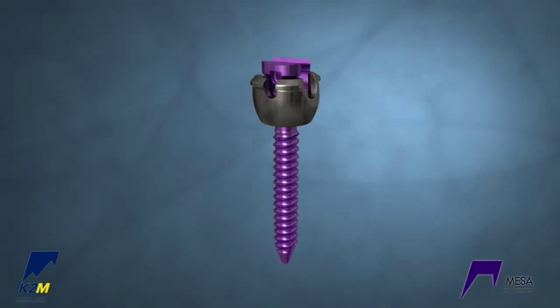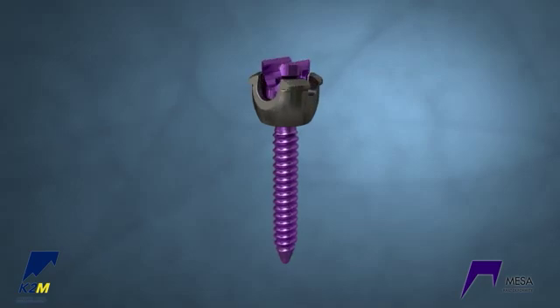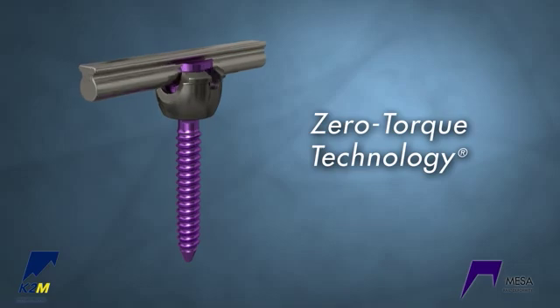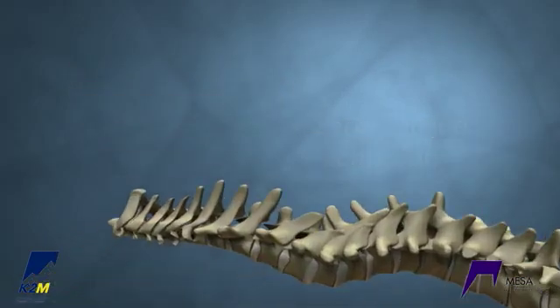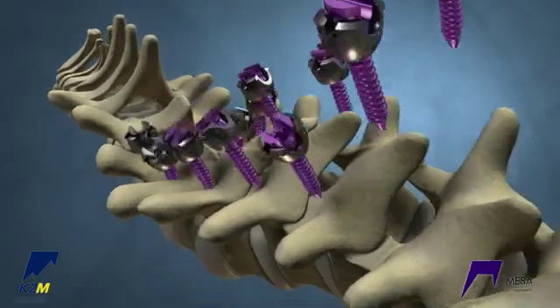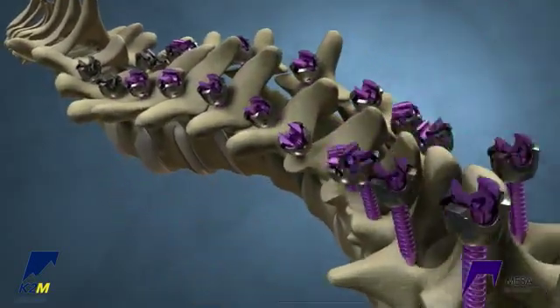The MESA screws are low-profile implants. The screws feature zero-torque technology, requiring no torque for final locking. Polyaxial screws are anchored proximally, and Deformity Uniplanar screws are used throughout the rest of the construct.